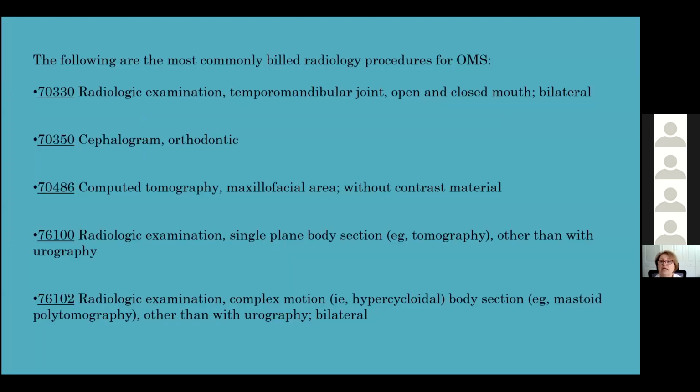So the following codes are most commonly billed under the OMS ruling: oral surgery, radiology exam, temporomandibular joint, open and closed, bilateral, the Ceph for orthodontic, computed tomography, maxillofacial area, always without contrast. We don't do contrast in our dental offices. If you need contrast, they should go to a facility that could perform that.